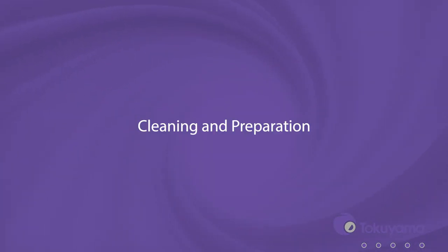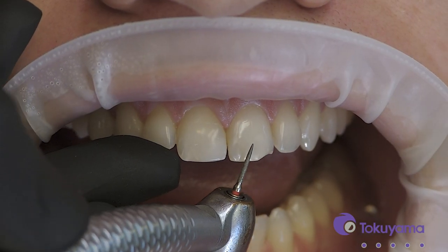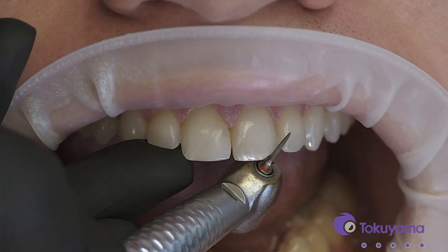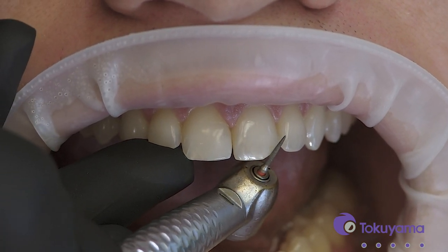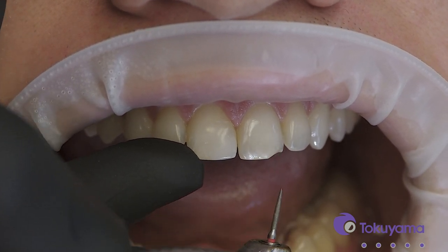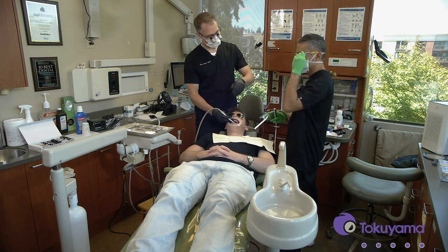To do this, I'm going to use a real fine grit flame-tipped burr. I'll go up at the tip at about a 45-degree angle, and then as I go up onto the facial, I'll wrap it more flush so that there's no definable finish line — it's just going to be a nice infinity edge.